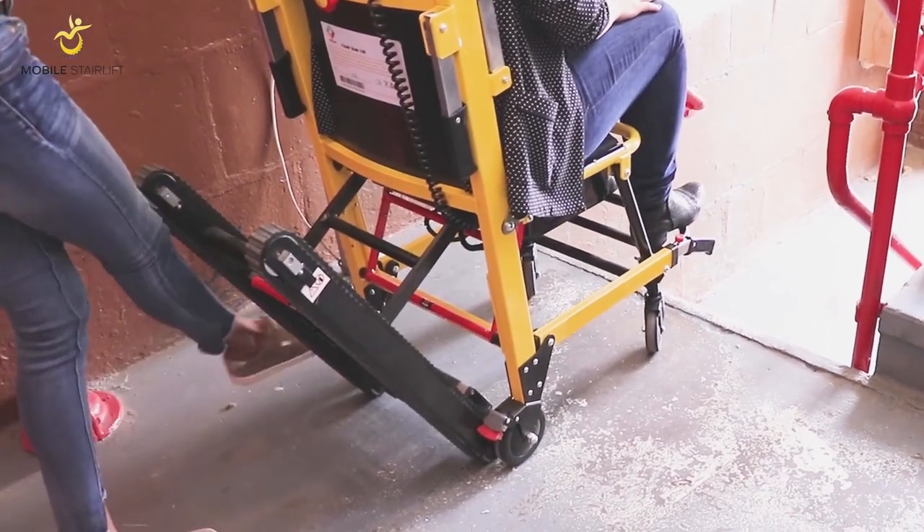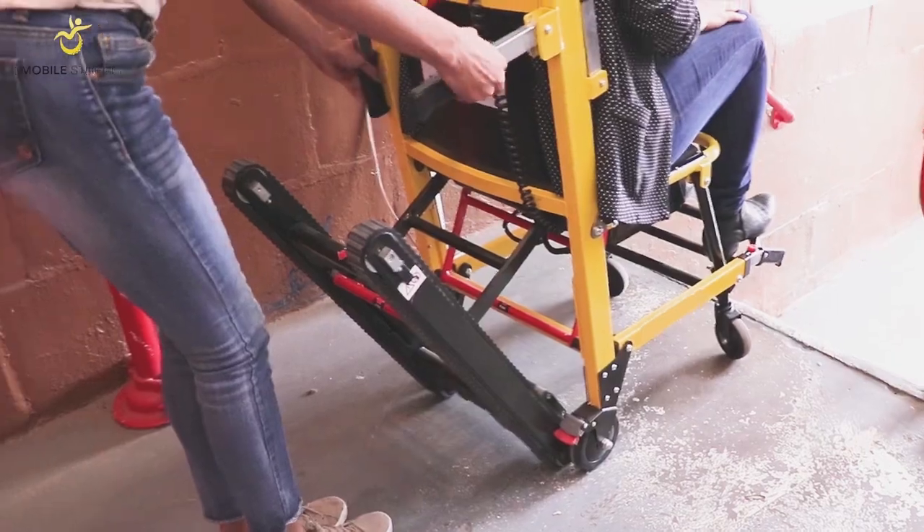When you are rolling the Stair Lift on flat ground, handles can be extended behind the seat.